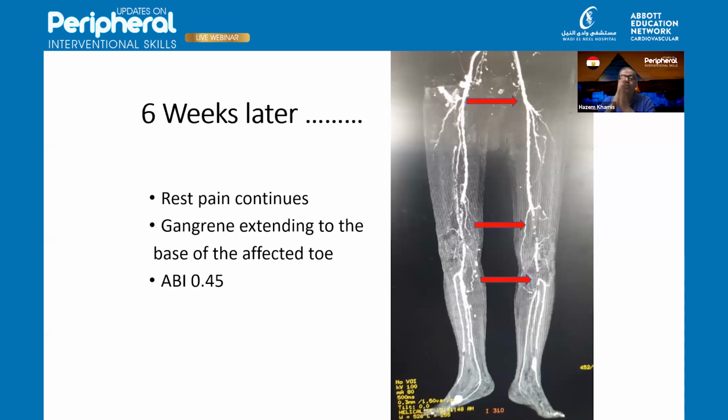Sharif, is there any role for drug elution balloon in this situation, the heavily calcified vessel, after conventional balloon? Well, this is not what I was looking for in this particular case, because we know that DCBs do not work very well in heavily calcified lesions. What we were looking for was a stent to deal with this anatomy, with these tough vessels. Due to some logistics, it was not available at hand at this point of time, plus with this partial improvement in the angiographic picture, we decided to stop the procedure at this stage and postpone any other interventions to a second stage if needed, while keeping the patient under close monitoring.